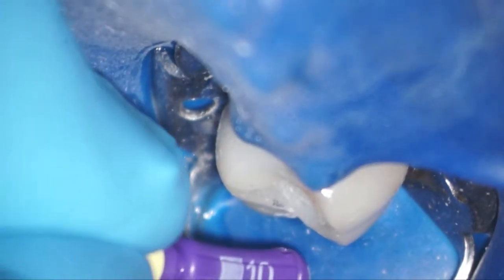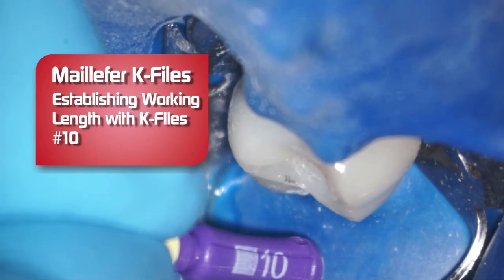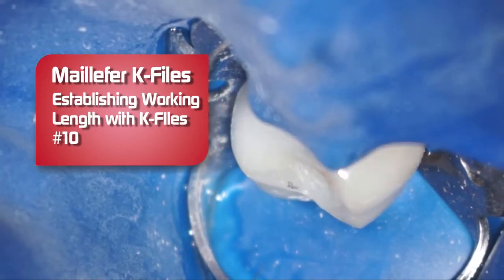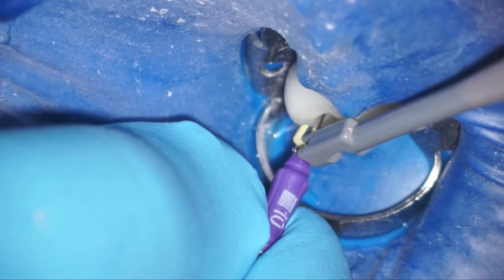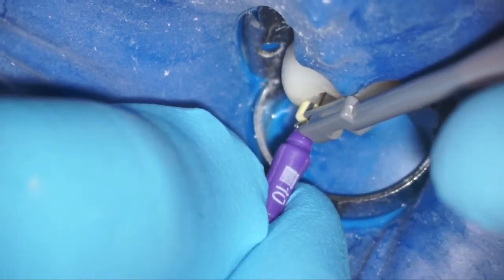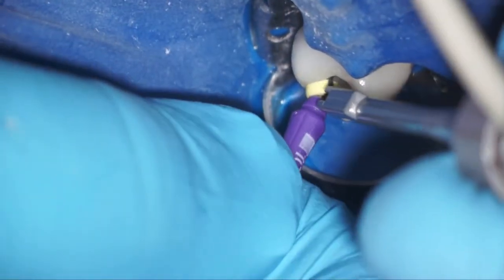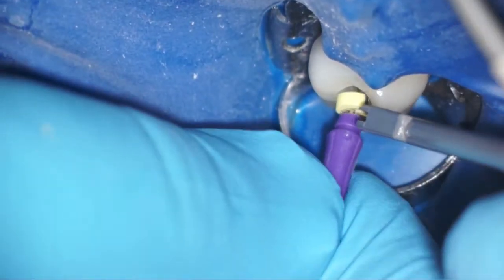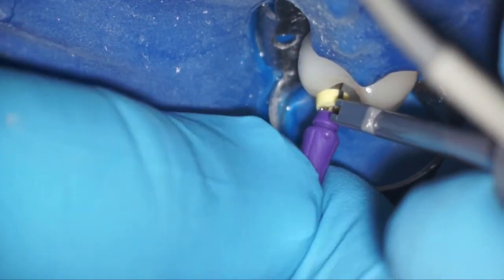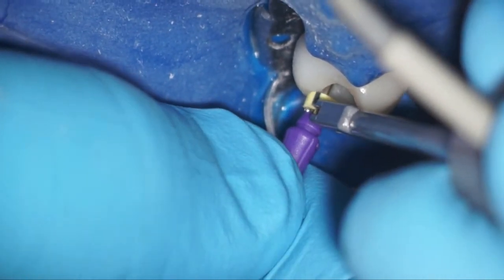We're going to establish our length here with a number 10 K-file, which is very, very thin and very flexible — just an easy file to use. Very flexible, so I like to use the 6, 8, and 10s to get around any curvature. And there we go, confirming our length.